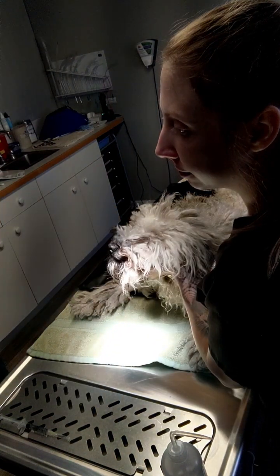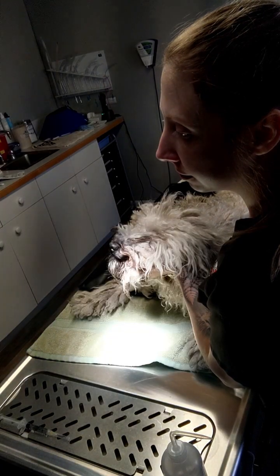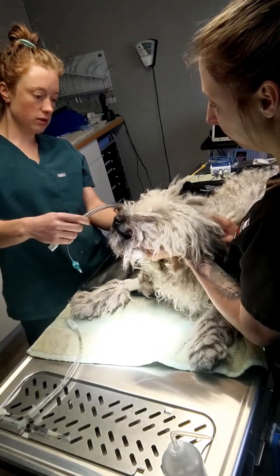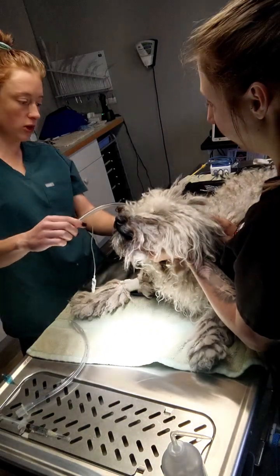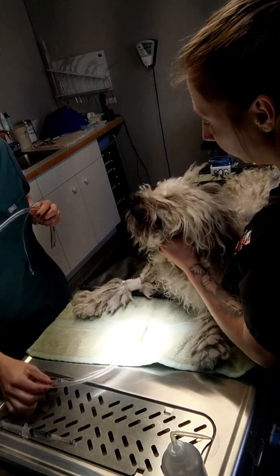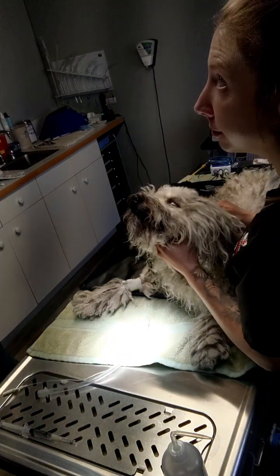So we've got a couple different endotracheal tubes, just depending on whichever one seems to fit her best. So we can kind of measure. This seems big to me, so we need this one. She's so small. And these have both already been leak tested, just to make sure that the cuff is properly inflating.